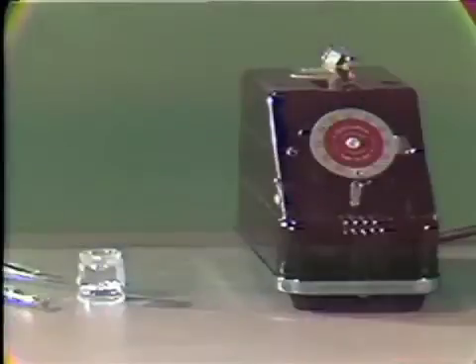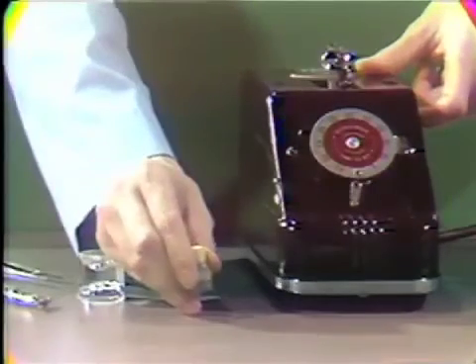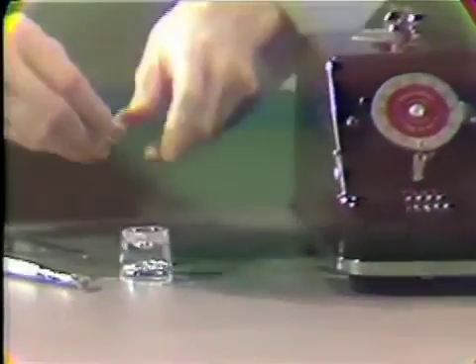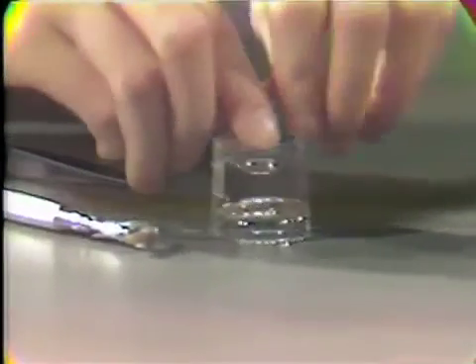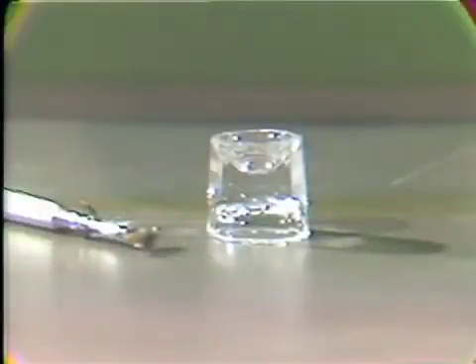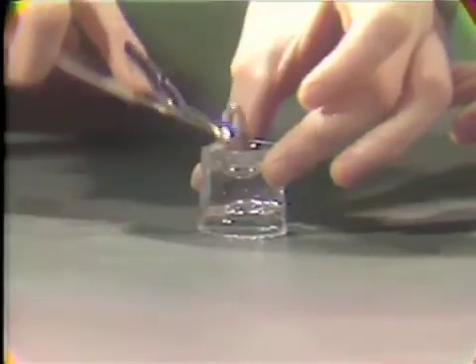When the mix is completed, remove the capsule and tap the capsule sharply on the table or hard surface. This will aid in releasing any amalgam that may adhere to the sides. Then open the capsule, place the material in a dappen dish, remove the pestle, and discard the capsule. The amalgam is then ready to be loaded and placed into the prepared tooth.